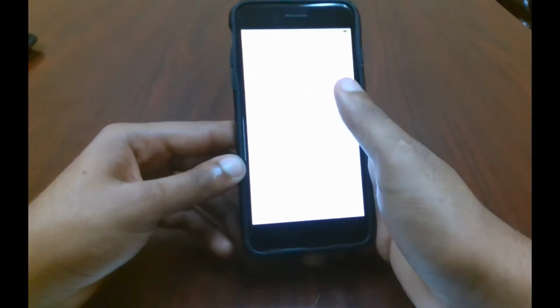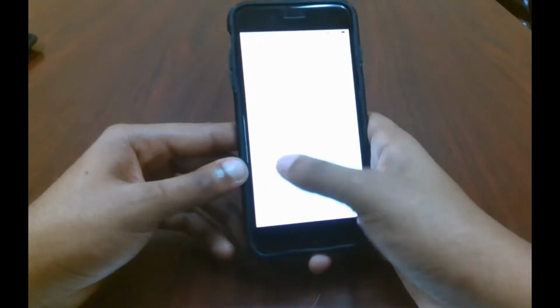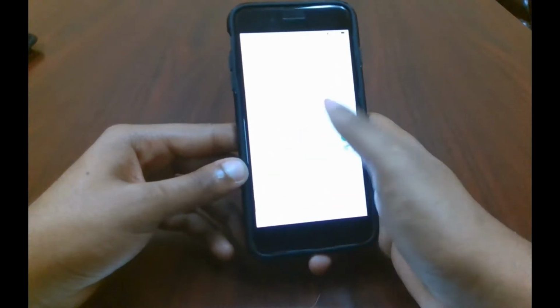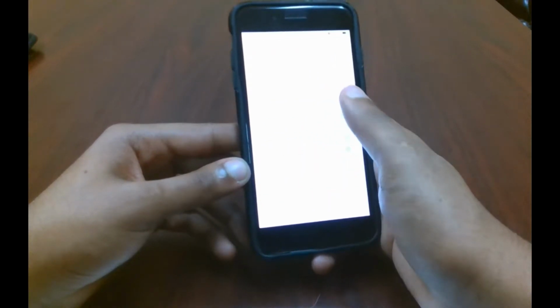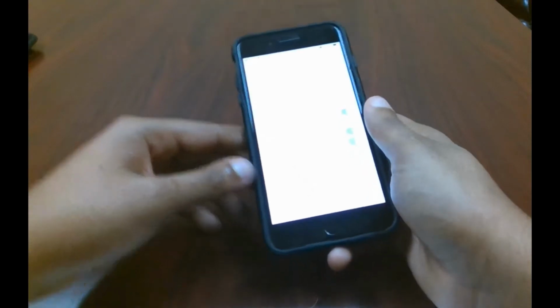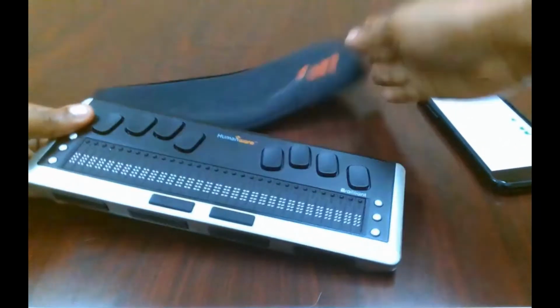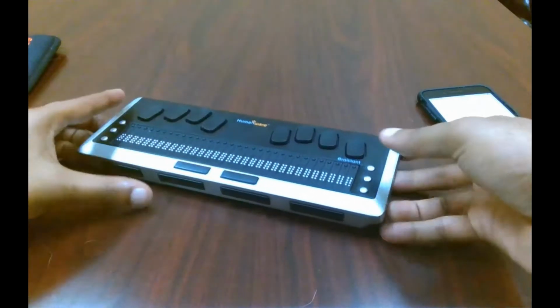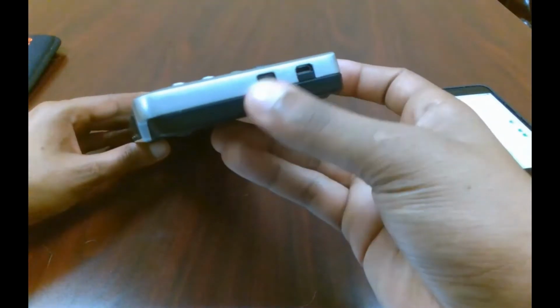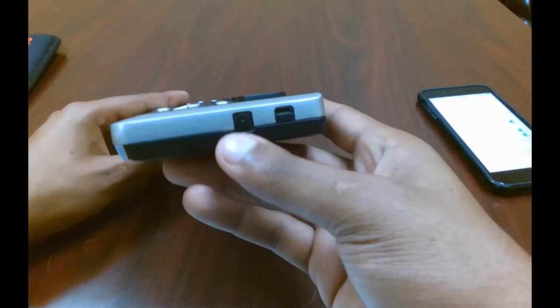So now you hear choose a Braille display, which will be searching. So there's an Apex I can connect to. And that's it right now. So now we're going to take the Brailliant out of its case, set that over to the side, and we're going to use this power button on the right-hand side underneath the charging port, which is just a standard micro USB.